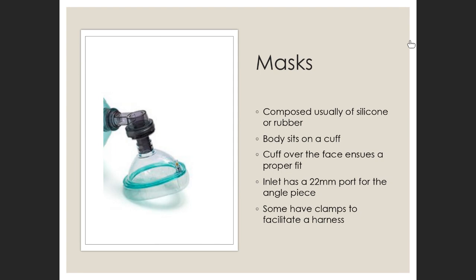Okay, so really, once there is no risk to the patient of aspiration, you can use an LMA. Other things that will decide whether you can use an LMA is how long the anesthetic is going to be, do they need relaxation, etc. So there are a few other considerations. And then when you actually come to do the procedure, does the LMA sit?